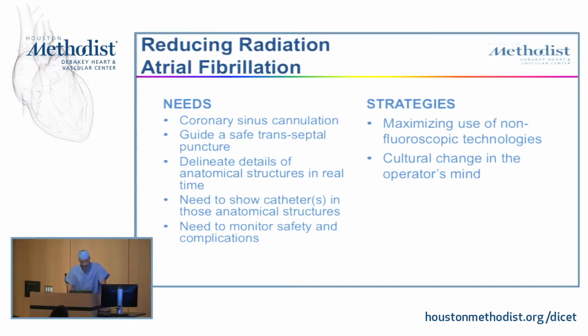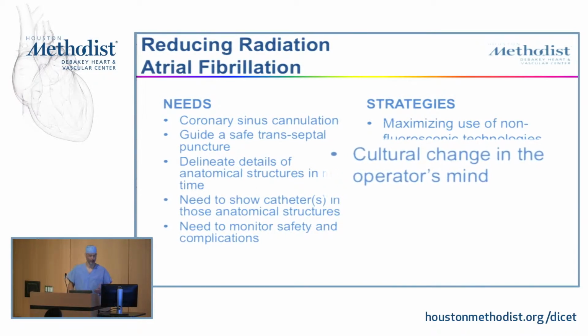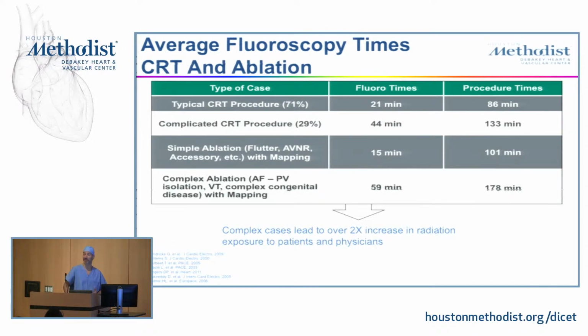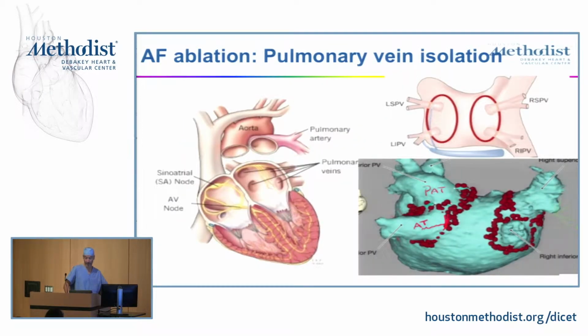And when we looked at this and figured, okay, what can we do? What do we need to do to decrease X-ray exposure? The thing is, we have everything we need. And the biggest challenge has been a cultural change in the operator's mind. And what works for us, as alpha persons, is competition. That is what actually did it for me. For many years, I was decreasing X-ray from 45 minutes to 15 minutes during an AFib ablation, to 5 minutes, to 3 minutes. And then I heard about this guy that was doing 0 fluoro, and I said, okay, I need to get that. And if it weren't for that, I wouldn't have done it. But this is just an example as to what we need to do.